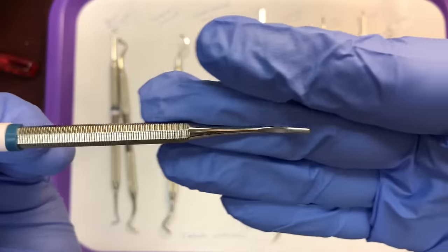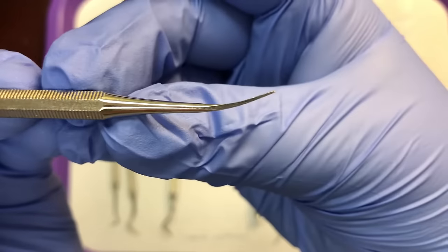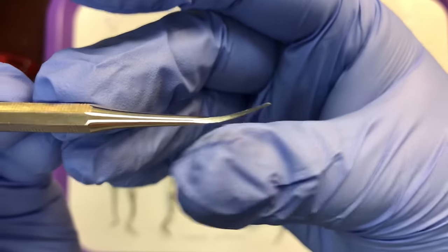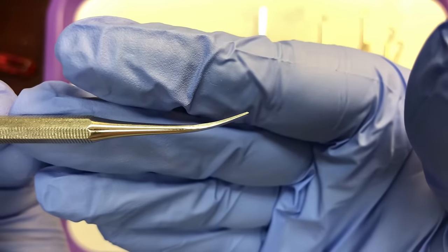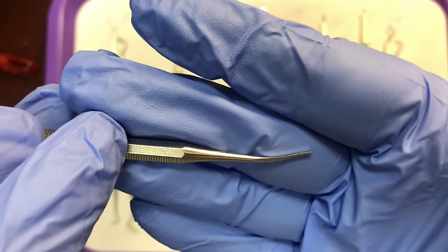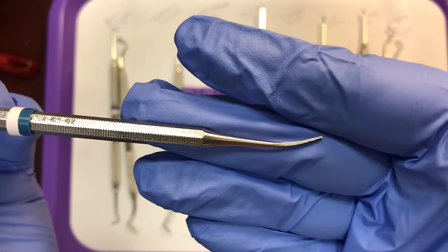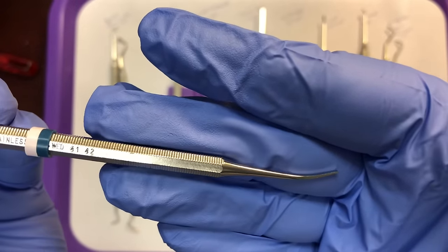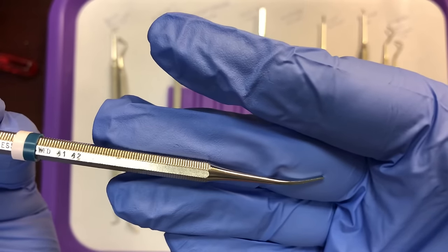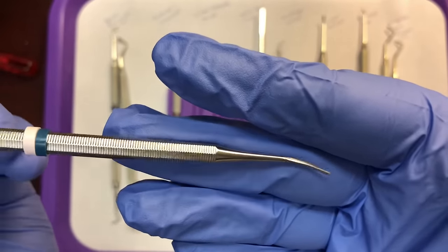Next up is the Wedelstaedt chisel. What's unique about the Wedelstaedt is that going from the handle to the working end, we have a gentle curved shank. Nearly all the instruments here for demonstration are double-ended. The Wedelstaedt is also used to prepare the teeth — it works with a pushing motion, where the doctor pushes it against the tooth to remove enamel and dentin, creating smooth walls and floors. The shape of this instrument is great for cavities near the gingiva.